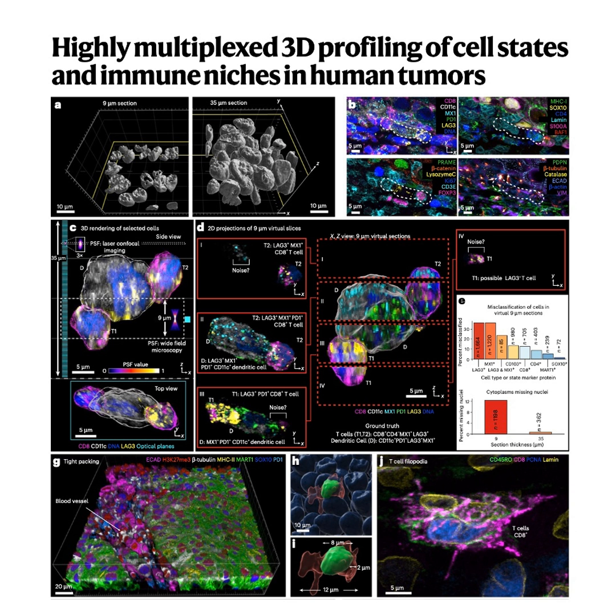The data they present is just... sure. It's a massive correction to decades of pathology. In those standard 5-micrometer sections, the ones used everywhere, fewer than 5% of the cell nuclei were actually intact. Hold on. Fewer than 5%. Fewer than 5%. Think about that. We've been trying to understand these complex, three-dimensional biological structures by essentially examining two-dimensional debris. Flat fragments, standard 2D imaging. Just because of the physical act of slicing that thin, it fragments approximately 95% of the cells you're actually trying to study. That's astonishing, 95% fragmentation.